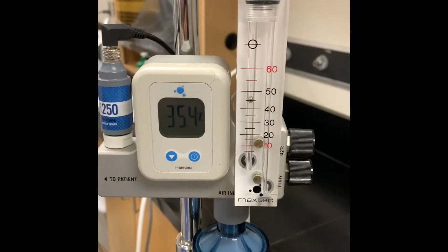Remember that you need to set flow first and then oxygen percentage. So watch the effect of changing flow rate on oxygen percentage leaving this device.